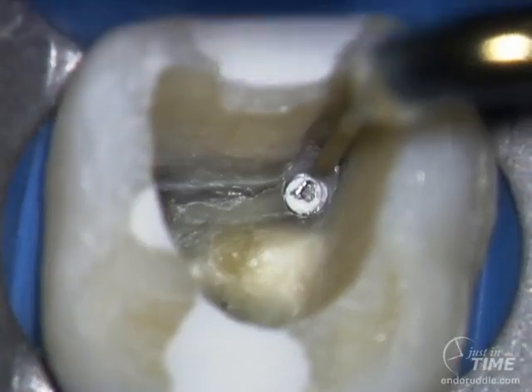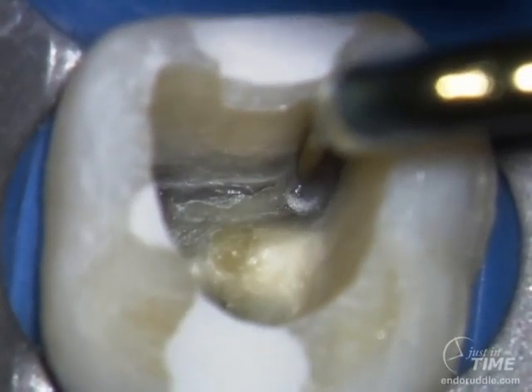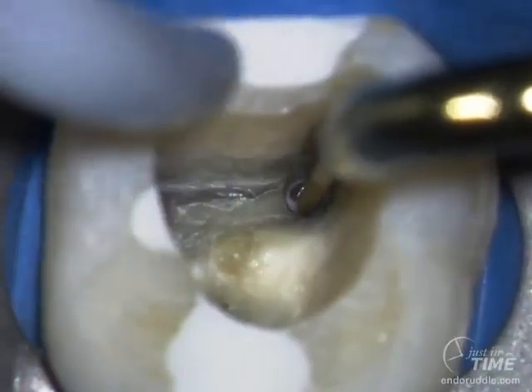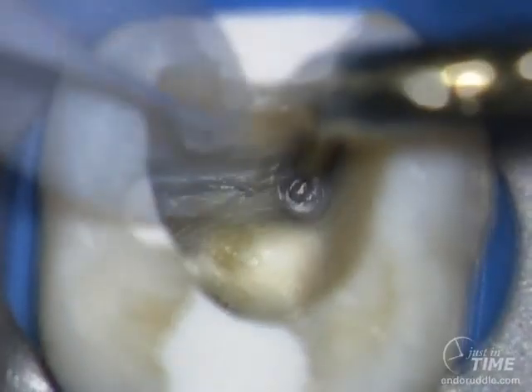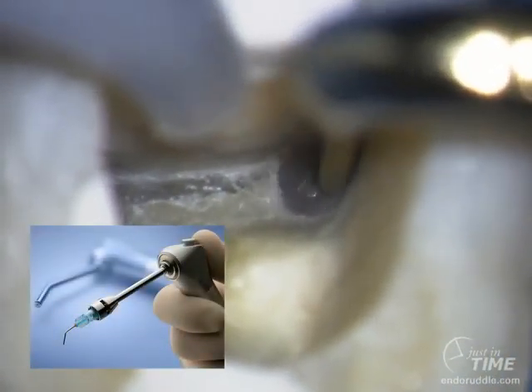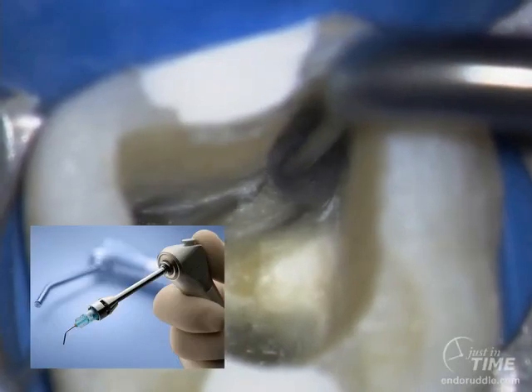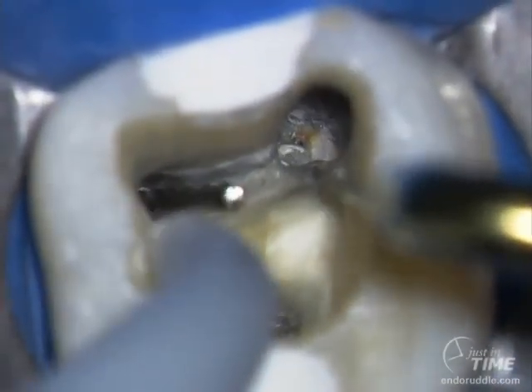Choose the ultrasonic instrument that has sufficient reach to the clinical field of action, and notice that it has a small diameter profile which allows me to continuously view the broken segment as I circumferentially trephine around the broken fragment. The assistant importantly is using a Whitemac tip and a Stropko three-way adapter so she can blow air and direct the air precisely into the field of action. You can see that the instrument has jumped up and out of the canal.